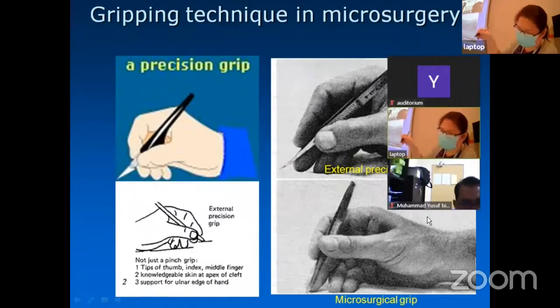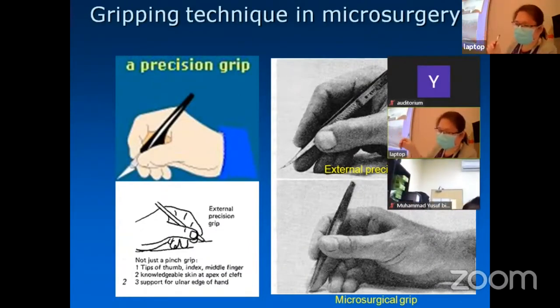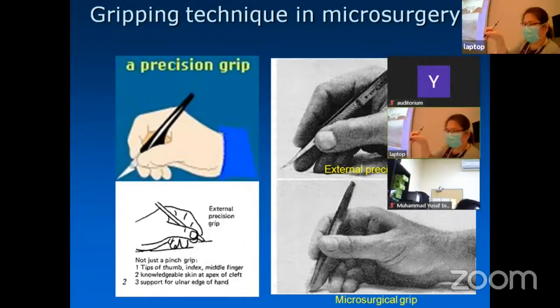And also, number three, you have support at the outer edge of your hand, as well as these two little fingers here. Okay. So, what is a microsurgical grip? Microsurgical grip is actually a modification of this external precision grip. In the microsurgical grip, the hand will be supinated 30 degrees from the writing position. From the picture, you can see the tip of the middle finger is resting, and you have your instrument resting on the index finger rather than the snuff box. So it's like this.